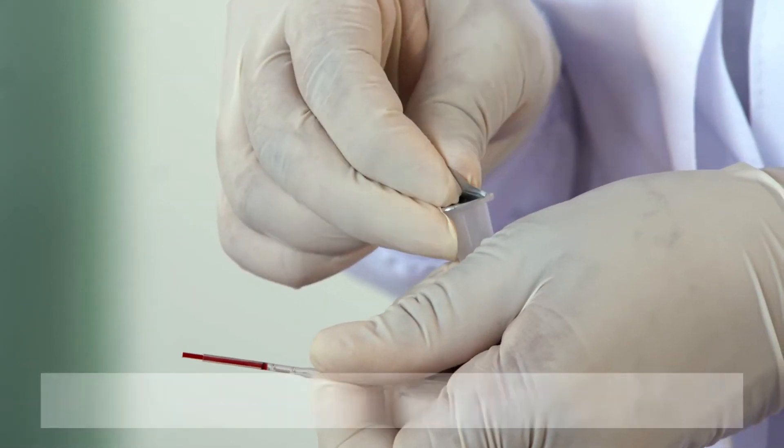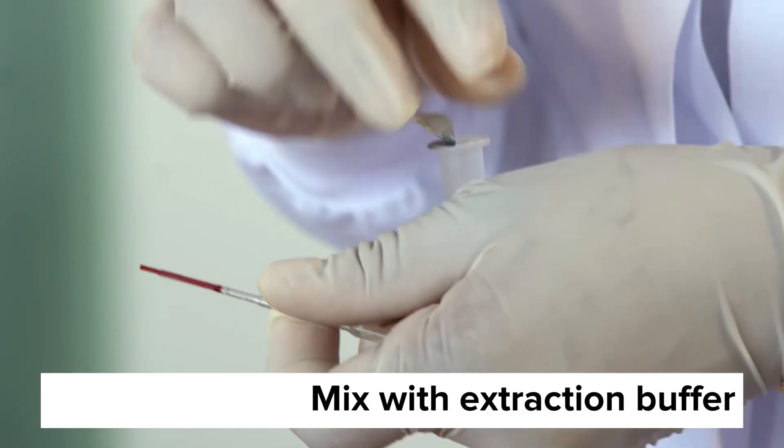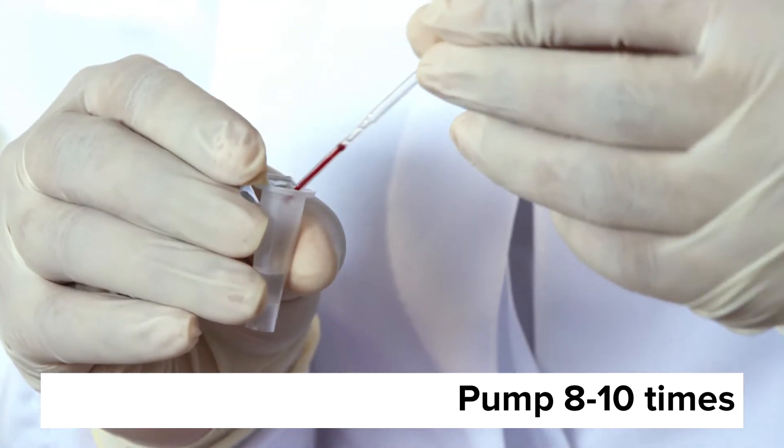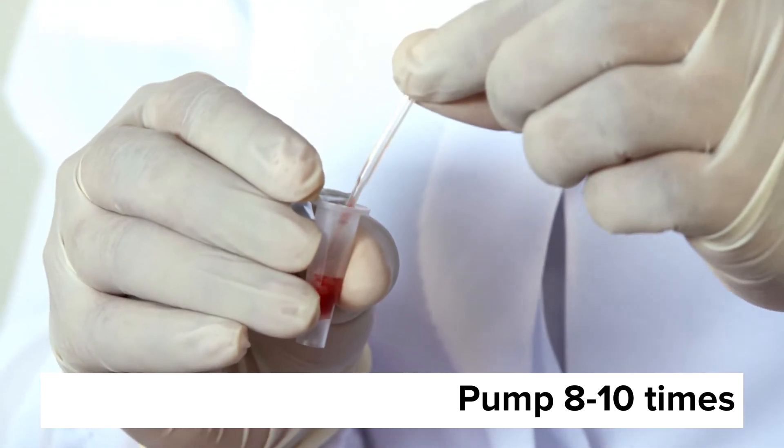Put the sample collector into the extraction buffer, press and release the bulb of the sample collector 8 to 10 times to mix the blood with the extraction buffer.